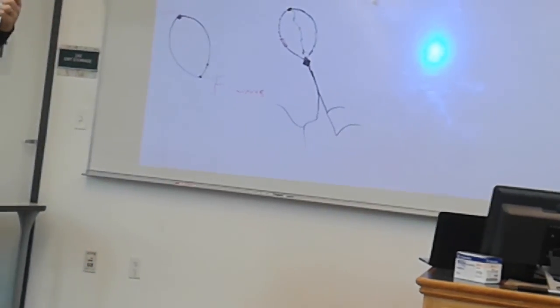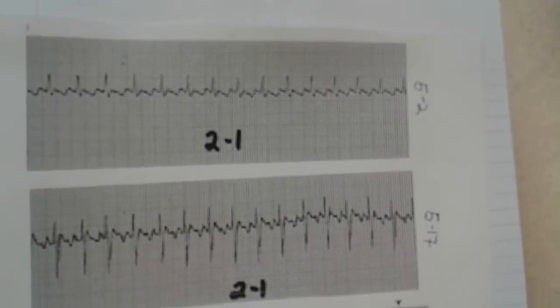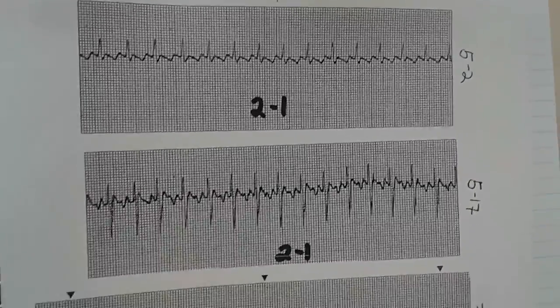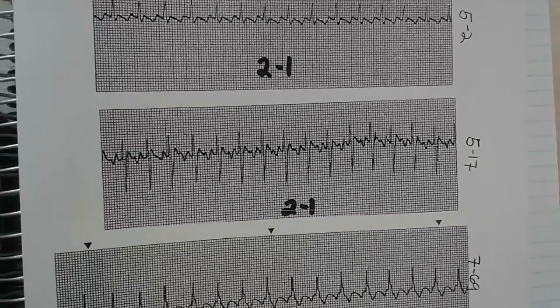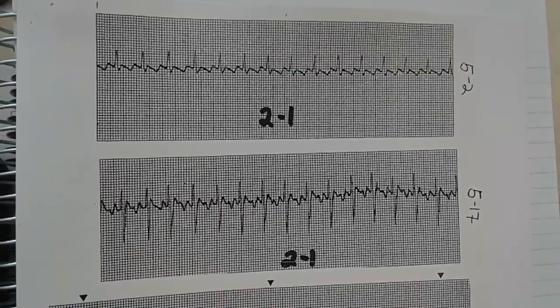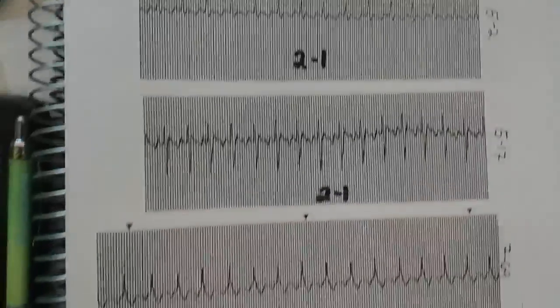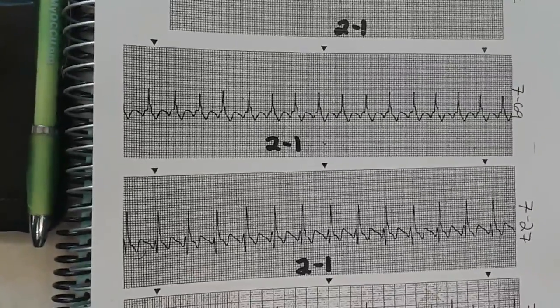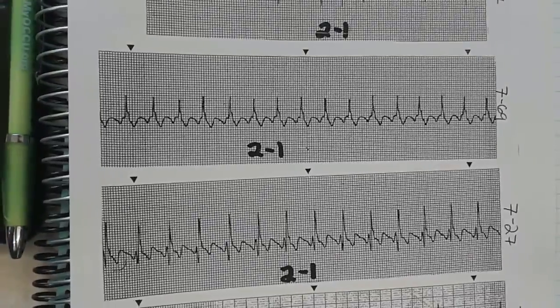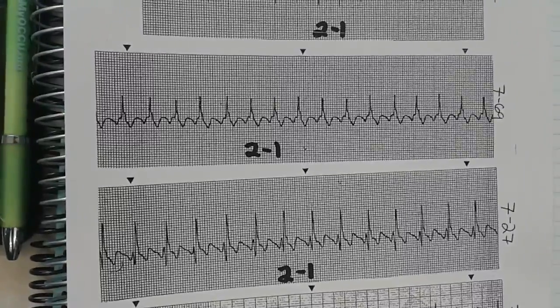So you note that in that first one, that 2 to 1, in the second half of the second F wave begins the QRS complex, and the QRS complex ends at the beginning of the first F wave within the system. Does that make sense? Same thing is true about the one right below it. Same thing is true about the third one. In the fourth one, note that you have an entire F wave hidden within the QRS complex itself, and it makes the QRS complex look what? Wide. It makes the QRS complex look wide.